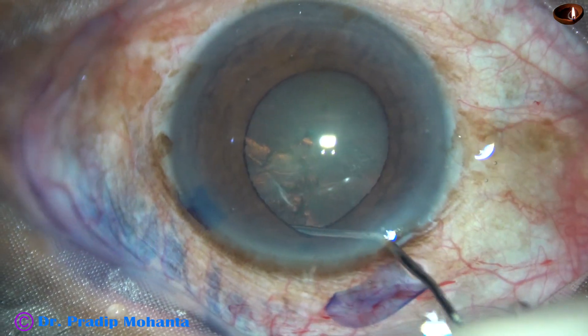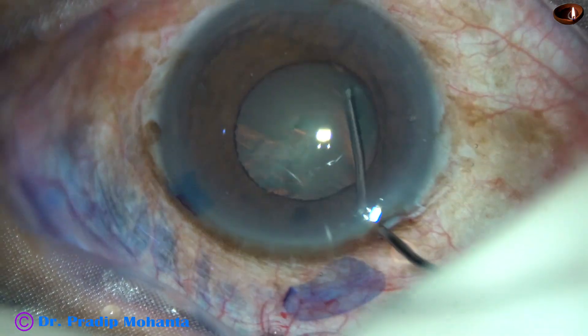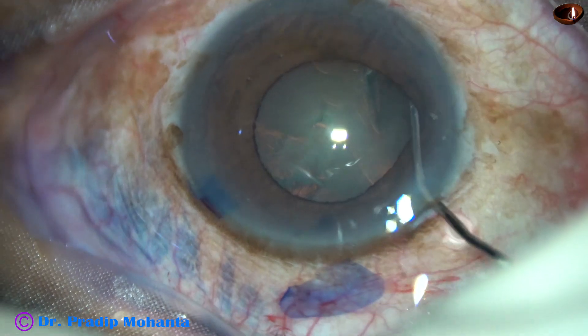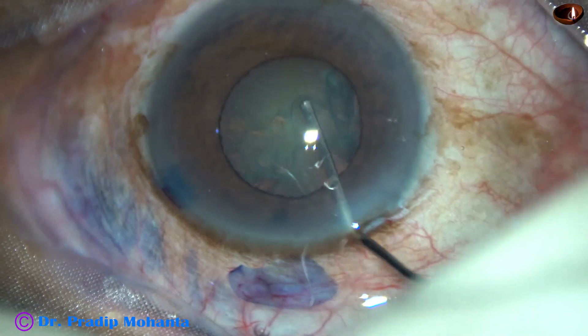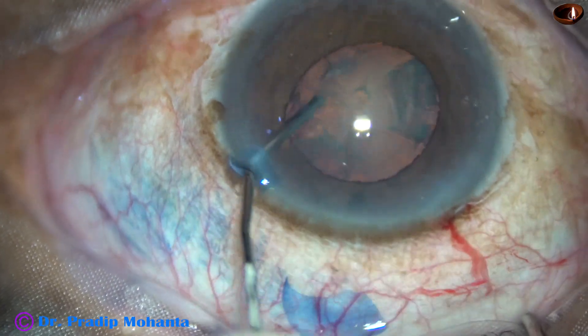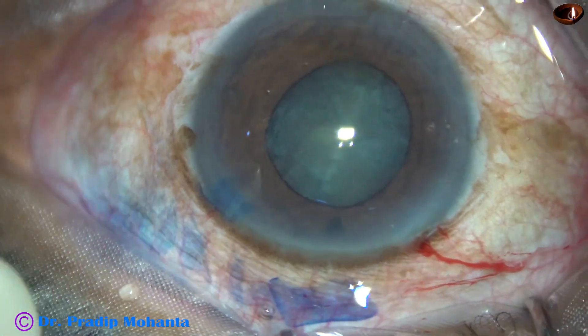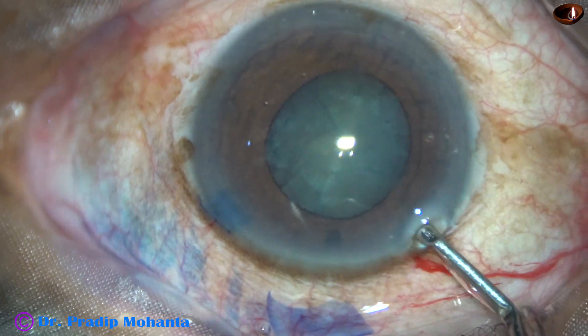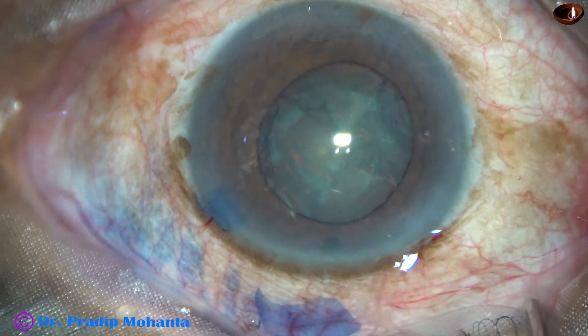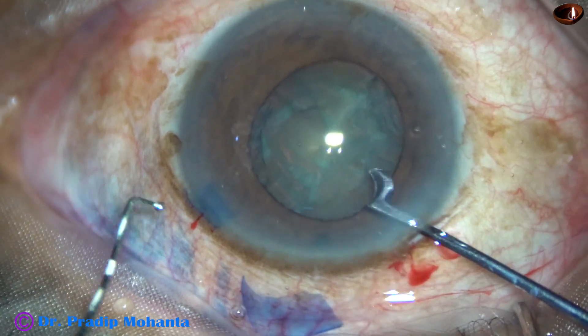Now hydrodissection is done. This is BSS and a 27-gauge cannula. In small pupils, you must be very careful to do hydrodissection. You must not inject a lot of fluid. There will be fluid build-up and the posterior capsule may give way. So we have to be very careful in such cases.